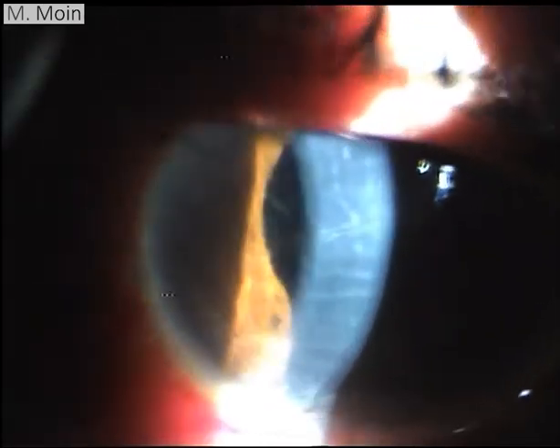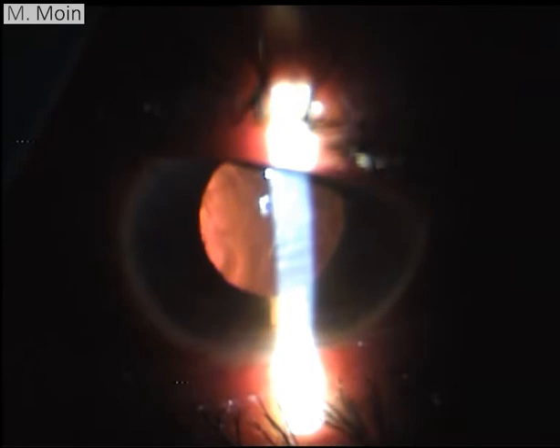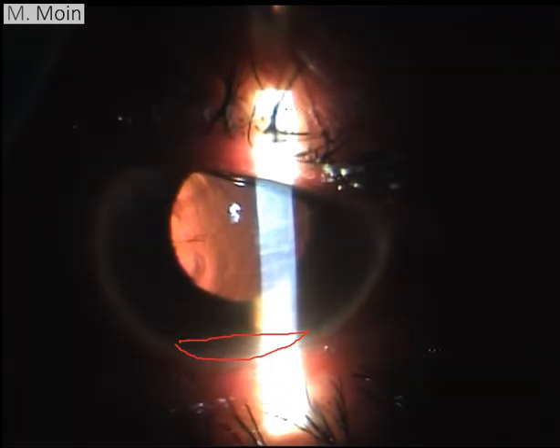And now I'm moving the light from one side to the other, and you can clearly see the striate keratopathy. And this is the red reflex. The red reflex represents that the vitreous cavity is clear and the retinal reflex is coming out nicely. And then again, I want to show you this level of cells in the anterior chamber representing a hypopyon. This was actually a patient post-vitrectomy for endophthalmitis, and these were layers of cells which we could see in the anterior chamber, and they resolved by themselves with continuous steroid treatment. There was not an actual true hypopyon in this patient.